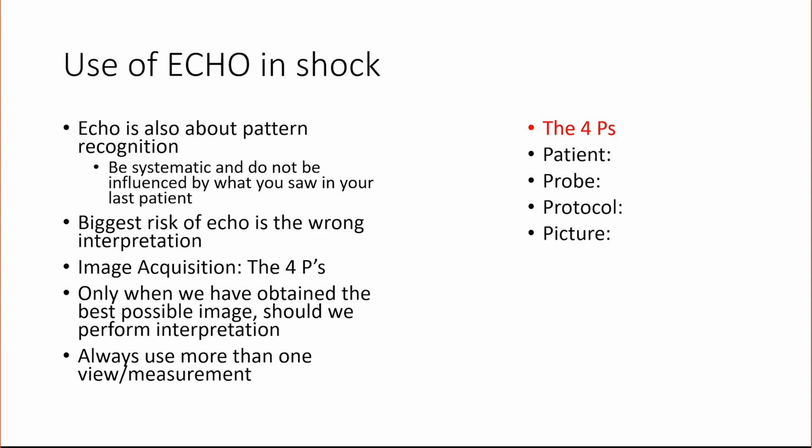Obtain the images, and then go back and evaluate those images and do your measurements. Don't try to interpret at the same time while you're doing the echo. Also try to make yourself as comfortable as you can while obtaining the echo images. Do it the way an echocardiographer does it.